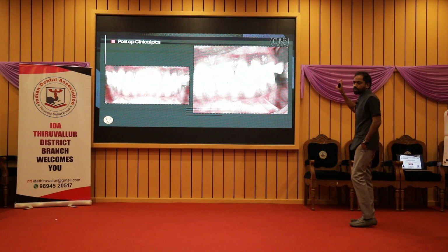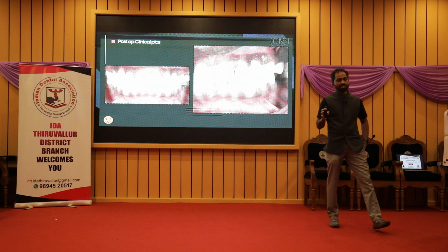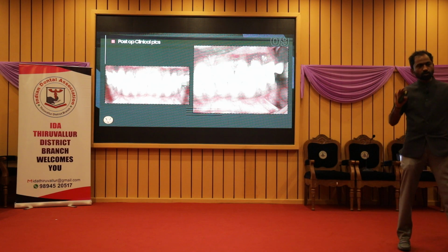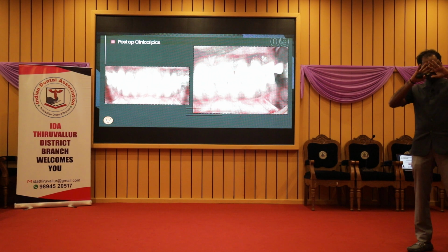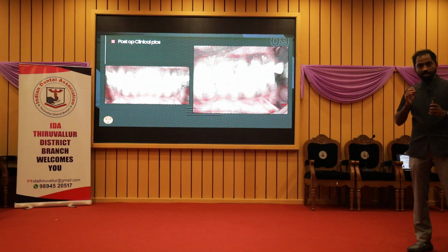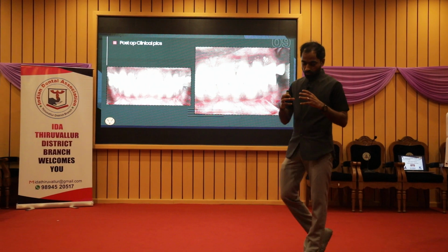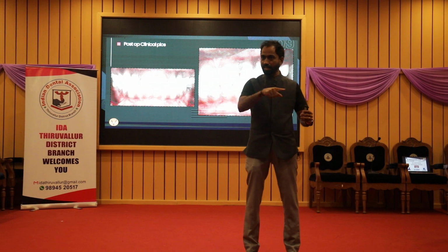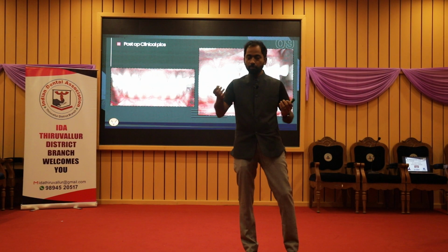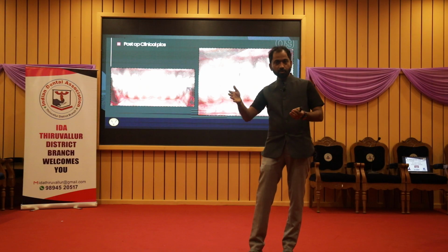So don't be in a hurry. Especially in the aesthetic zone, it is mandatory that you give a healing screw, wait for some time, let the keratinized tissue heal. What happens is, you have your stock with you, your healing screws, everything. I'll put it in a medical box, Monday, Tuesday, Wednesday, like that. I'll pick up. That's a good idea if somebody wants to use that. I'll buy it online, and for each implant, I will put it like that.